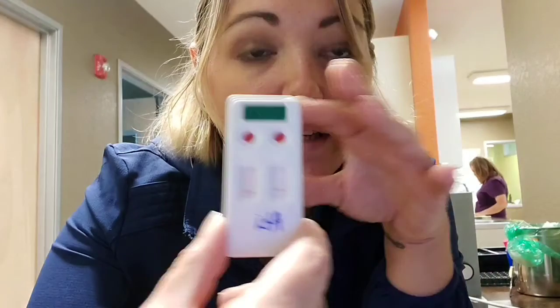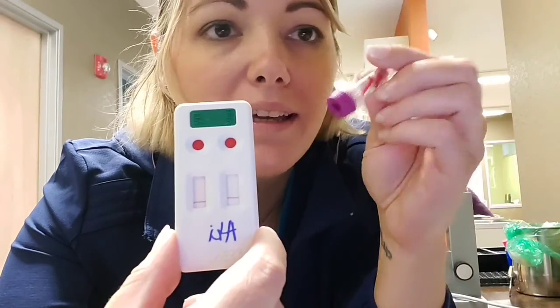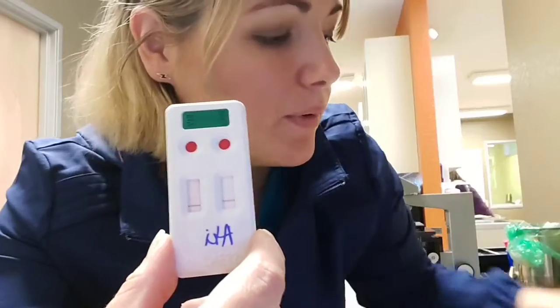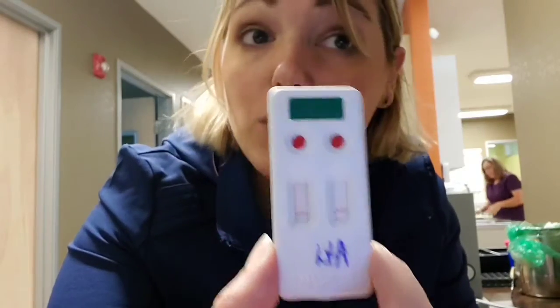FeLV, FIV test. And we did use, as I said before, the whole blood EDTA unclotted sample here, instead of the serum or plasma that can also be used to perform these tests. And that's it.